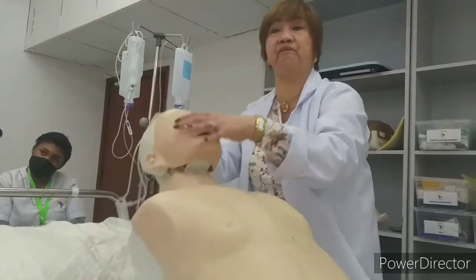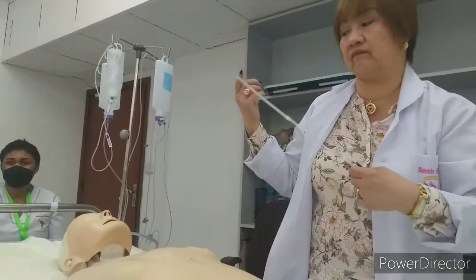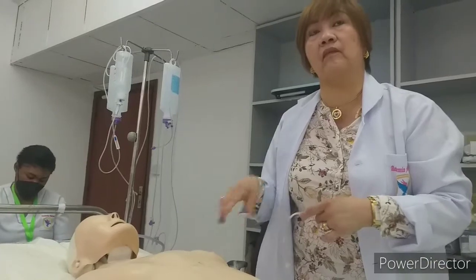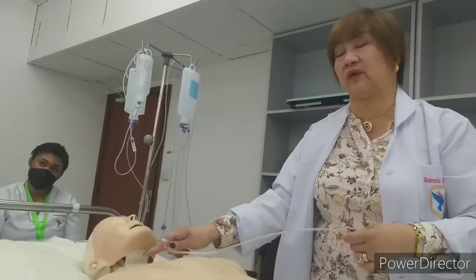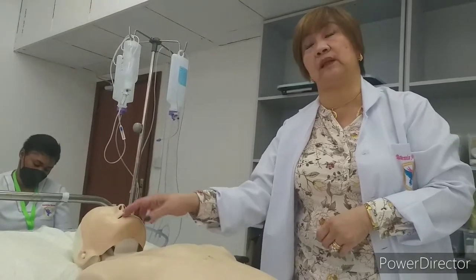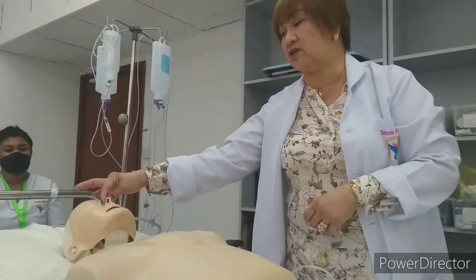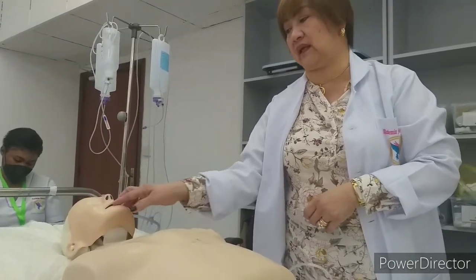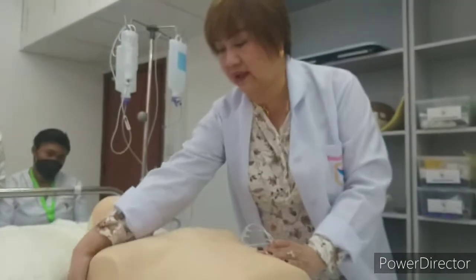I have a question. So sometimes we give this oxygen, but the patients don't have this tracheostomy here. Sometimes they don't have, but we'll give just from the nose only. It doesn't matter whether they have or they don't have. So we will put it according to how they require. They require only here, put it here. If the doctor said, okay, just put it. If the patient has an orogastric tube, so there is already a tube in here, so use the nose. Okay? You do not make it two here.